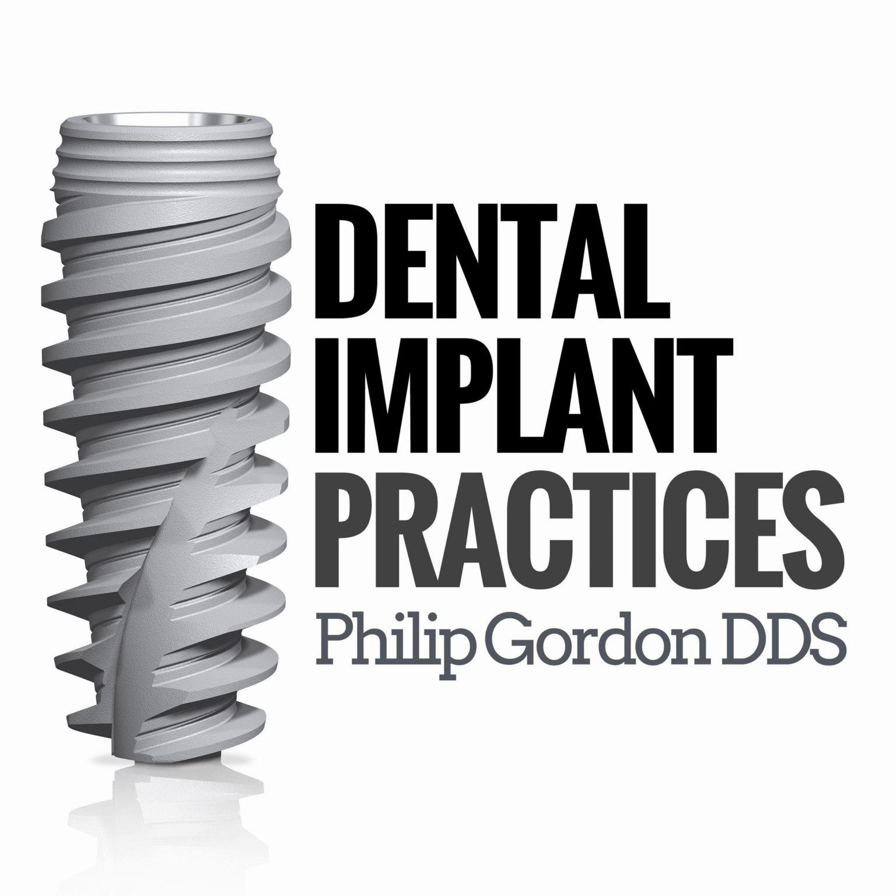Correct. So if you're doing just a one tooth implant, say we're doing nothing in the aesthetic zone, so let's say from 5 back and 12 back. We would need our online RX, which is filled out at nsequence.com. It gives us all the information we're going to need for the case, everything from name, patient age, doctor, where we're shipping it, those sort of things. And then we would, of course, need a CBCT scan of the patient.